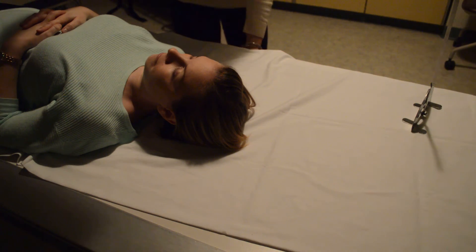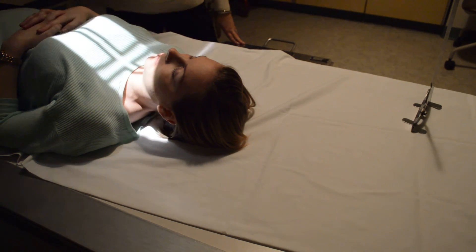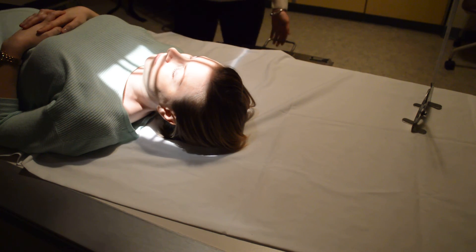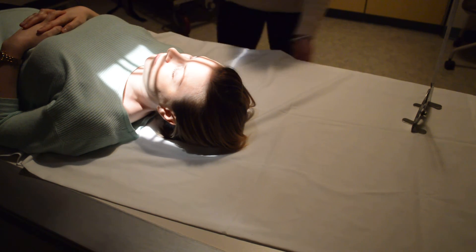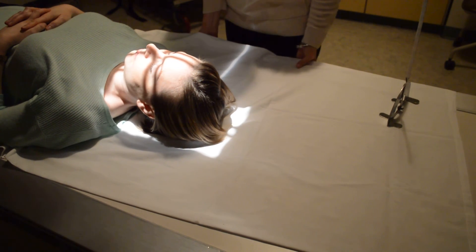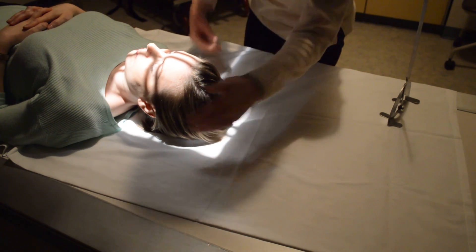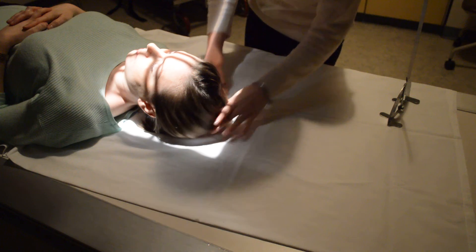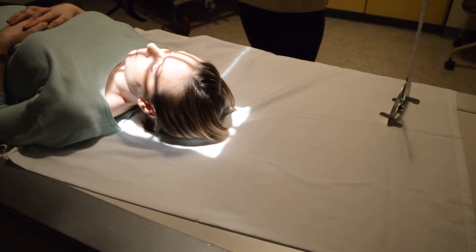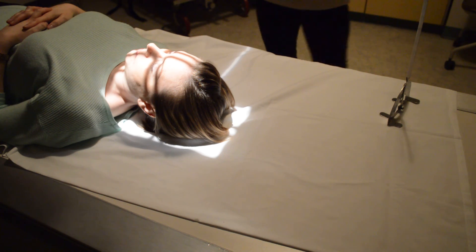I'm going to line up my bucky. For our regular Caldwell, we're exiting at nasion, so instead now we're just going to be entering at nasion. You still want to be mid-sagittal. Make sure you have the top of the head and you're collimated to the outer margins of the skull. You can't manipulate for any rotation or tilt, so just ask your patient to hold still and click.